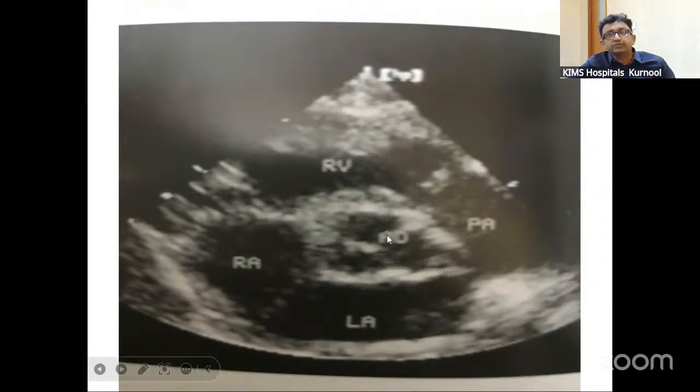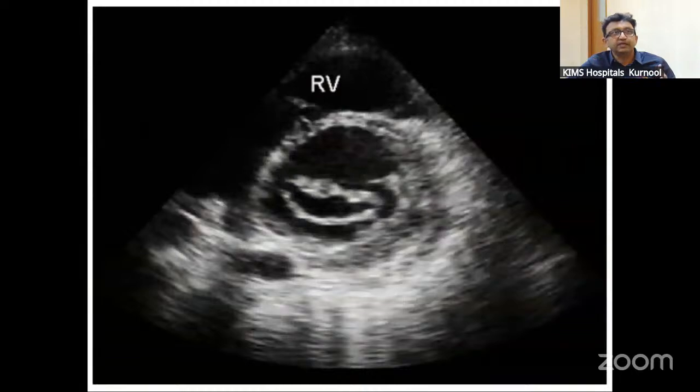Right? Because it's a short axis cut, the first cut in the beginning shows our aorta with the whole heart wrapped around it. You can also see coronaries coming out of the aorta in this view. Then we start doing multiple cuts along the heart until we reach the apex. The apex, as we know, is formed by the left ventricle. So the next view would appear like this, where you can see that this is the mitral valve.